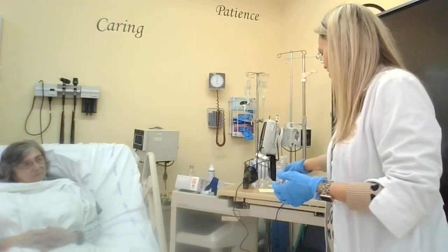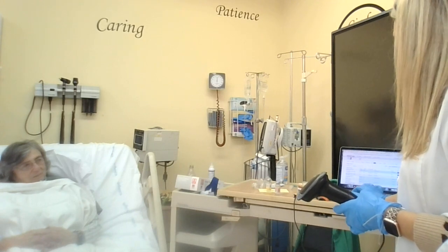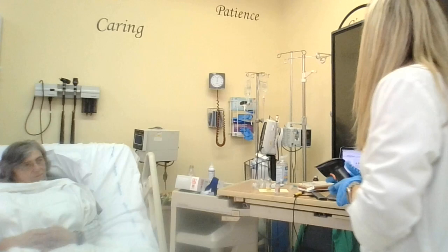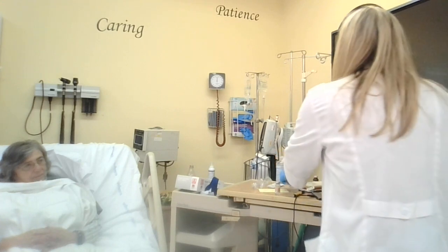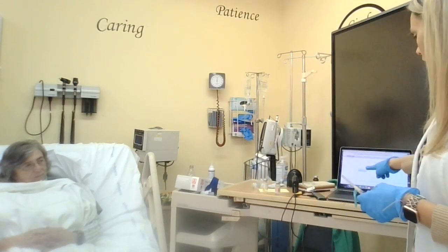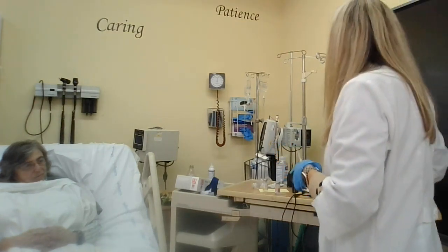Okay, so for your next medication, I'm going to be giving you your Fluzone. Now, since I've already scanned her ID, DocuCare remembers that, so I do not need to scan her again. I just have to click on my Fluzone before I can begin my 3rd check. I've already verified that I'm in the correct chart, but I have to tell DocuCare that I'm going to be scanning the medication. So I've got my Fluzone for Chris Jones. I'm giving 0.5 milliliters intramuscularly at noon, so I can scan that and verify on here that I've given the correct dose, route, and time. I didn't mention, but for the sub-Q and the IM, you can actually key in where you gave that so that the next nurse is aware of where you gave the injection. Okay, so I'll leave it like that.